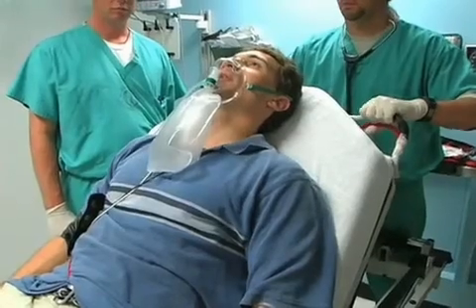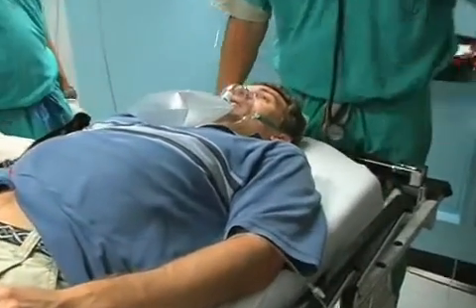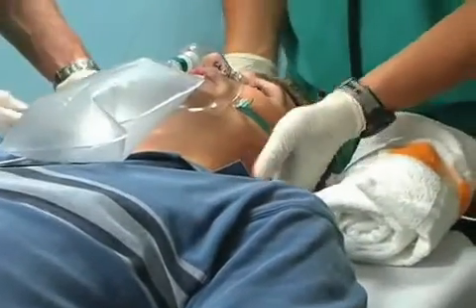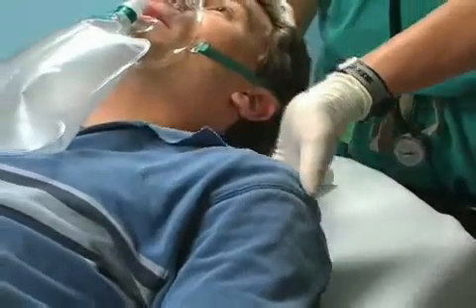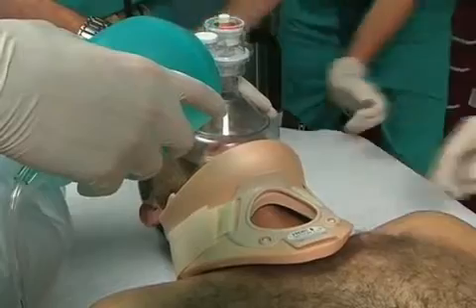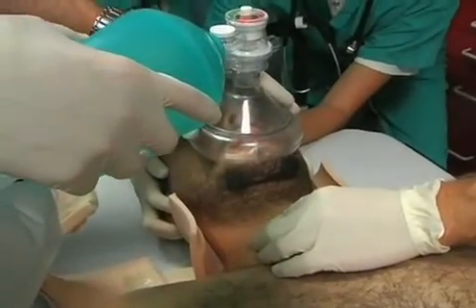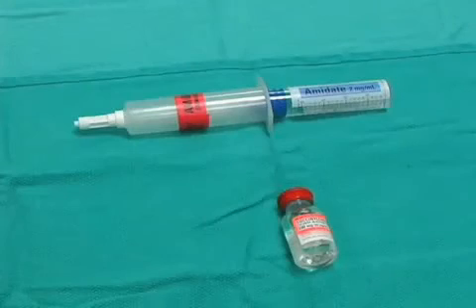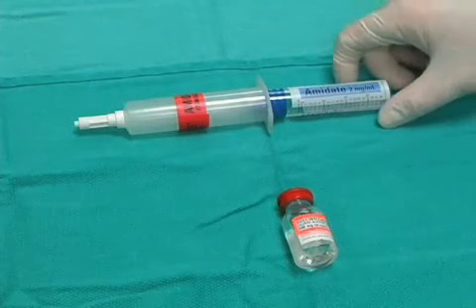The head of the bed should be lowered, and the patient should be positioned with the head extended and neck flexed, possibly using a roll towel underneath the occiput. If C-spine injury is suspected, the head and the neck should be maintained in a neutral position with an assistant performing in-line stabilization.